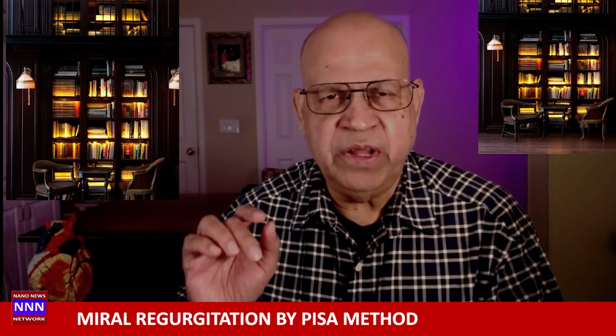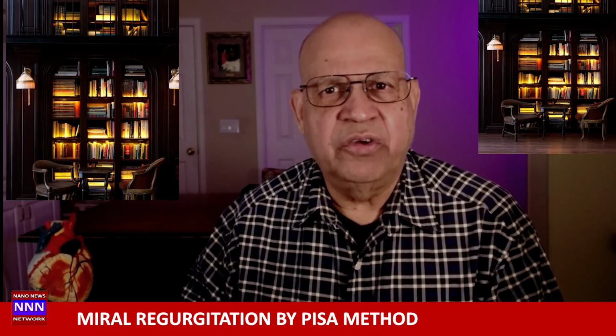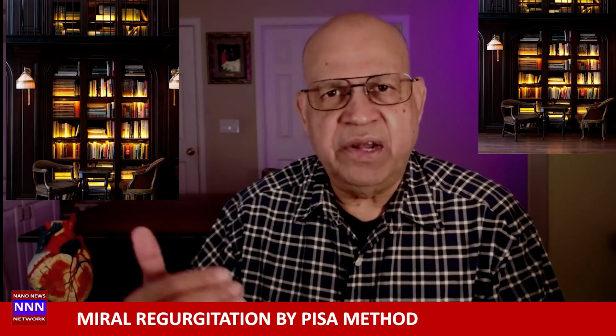So this is going to be a very basic concept-oriented presentation so that we understand how we calculate the mitral regurgitant volume and why it is important to go through the steps manually, because if you are a technician or a cardiology fellow taking an exam, this information is going to be extremely useful as it talks about the basic fundamentals, math, physiology, and flow and area relations. So let's begin with the feature presentation.